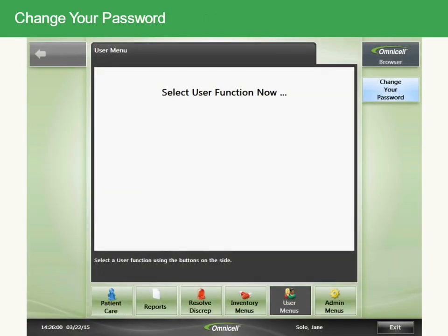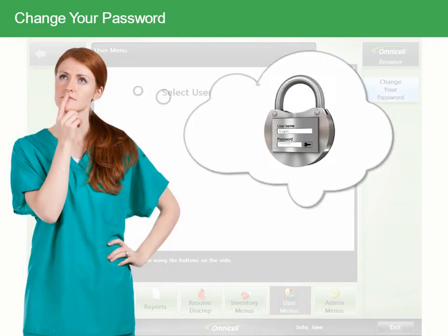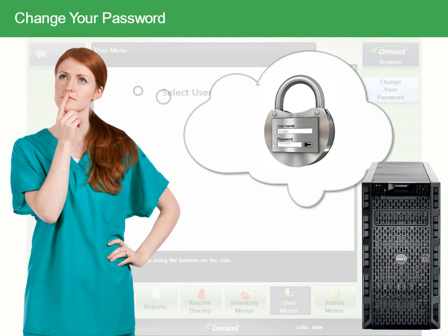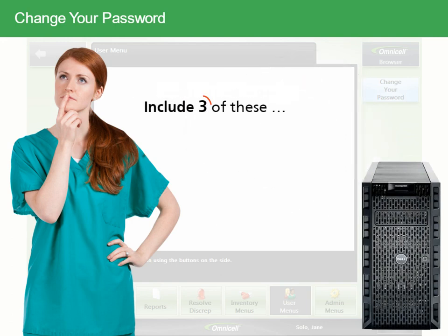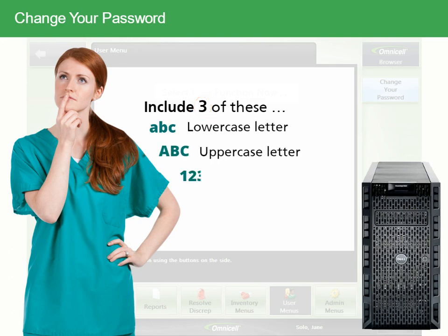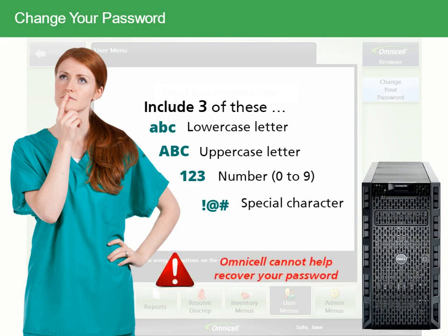You can change your password in User Menus by touching the User Menus button. Depending on your facility's policies, you may be required to have a strong password. Strong passwords must contain three of the following four elements: a lowercase letter, an uppercase letter, a number from 0 to 9, and a special character such as a dollar sign. If you forget your password, you'll need to contact your system administrator, as OmniCell cannot help you recover or create a new password.